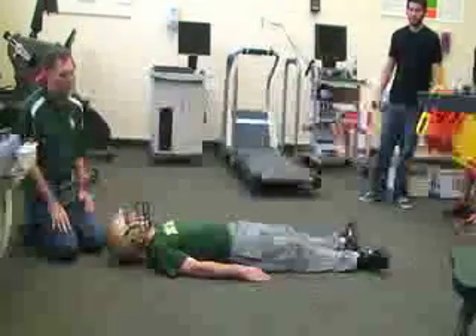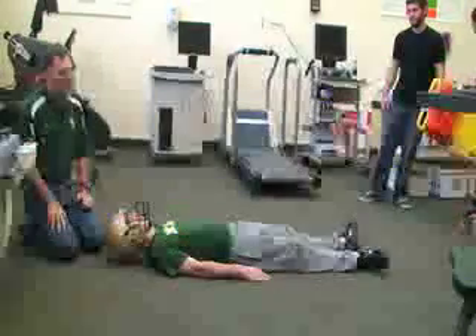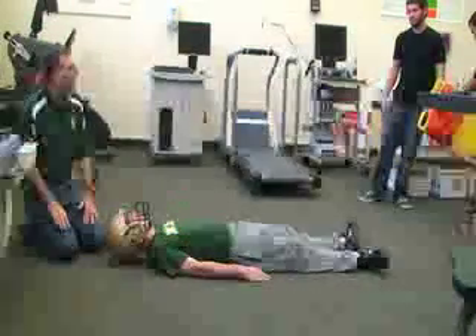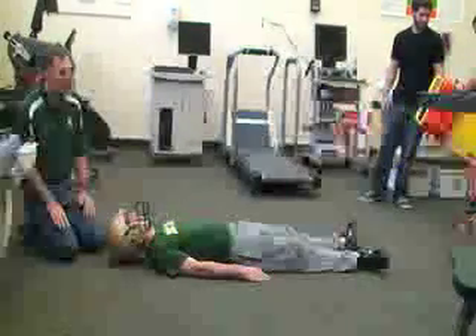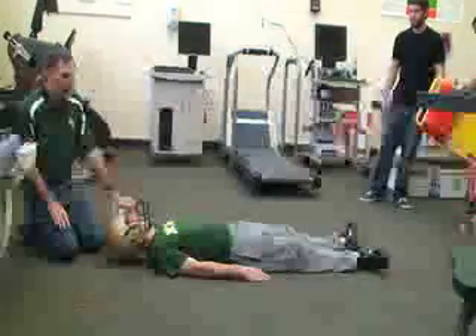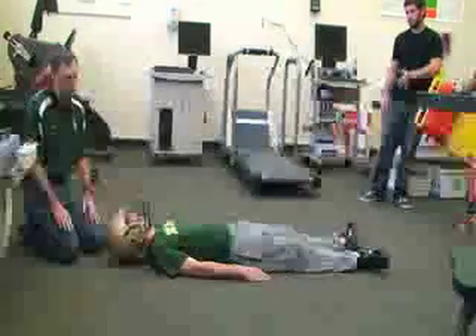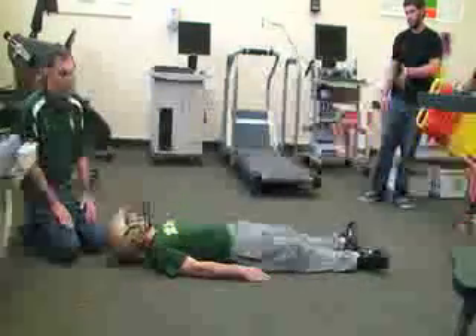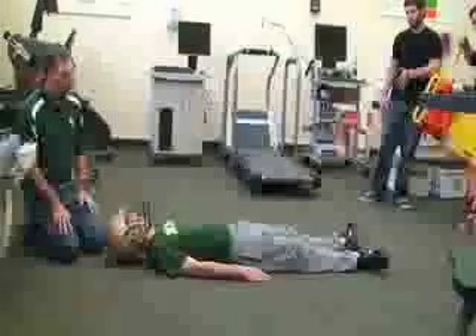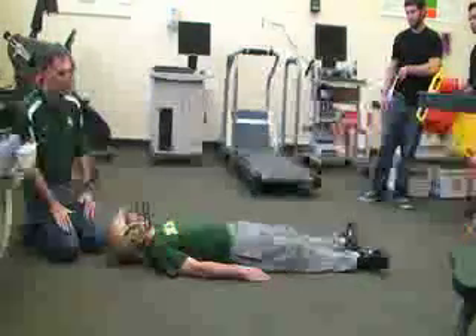Next we're going to be doing a spinal cervical spinal mobilization and backboarding using a backboard and head immobilizer. This time the patient is found in a supine position and he's wearing a football helmet. He has football pads on as well, which we won't do in this video. We won't be using the cervical collar.